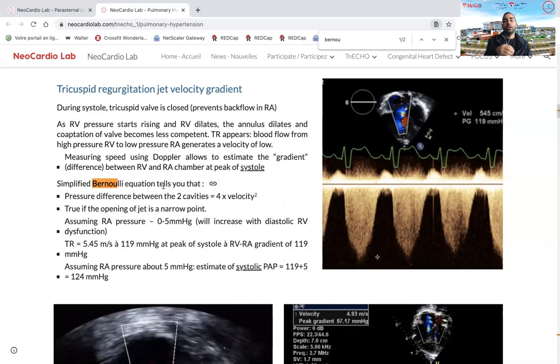And eventually the flow will come out with a certain velocity. Pss, pss, pss. And so this velocity can be translated into a pressure gradient between the inside of the hose and the outside world based on the velocity at which this flow is occurring.